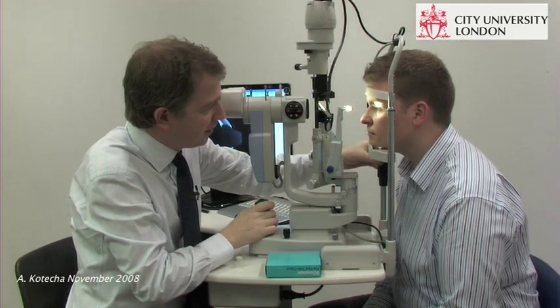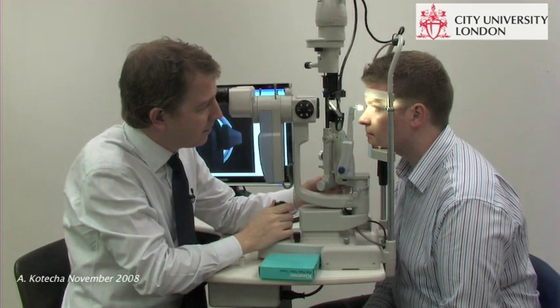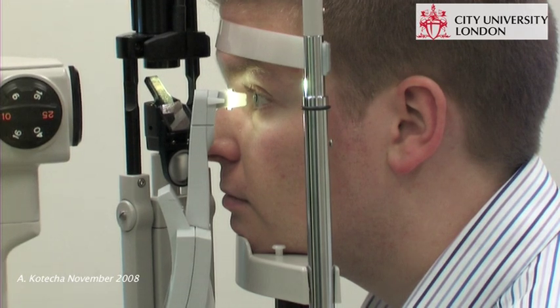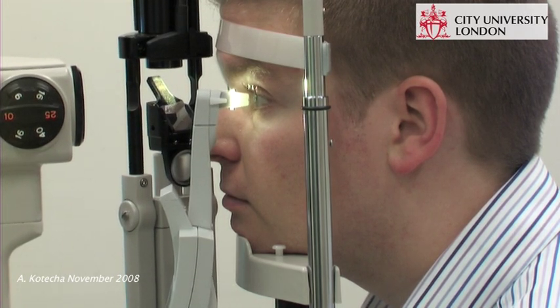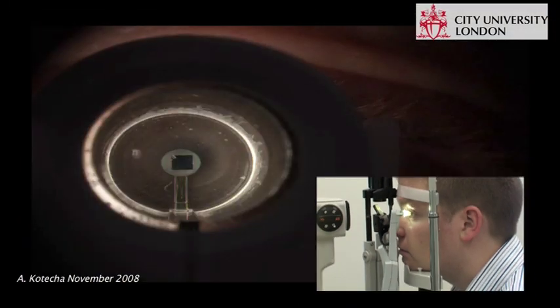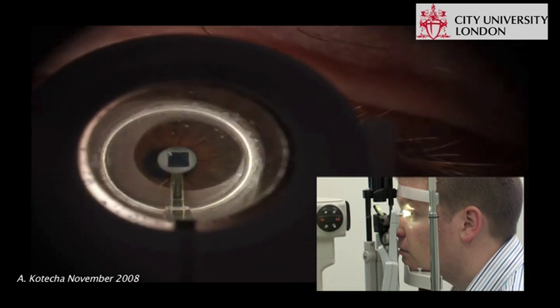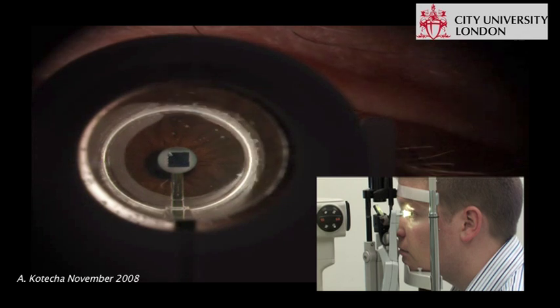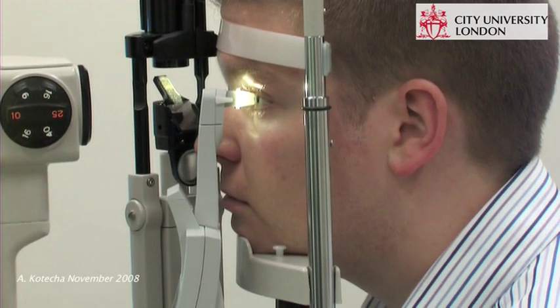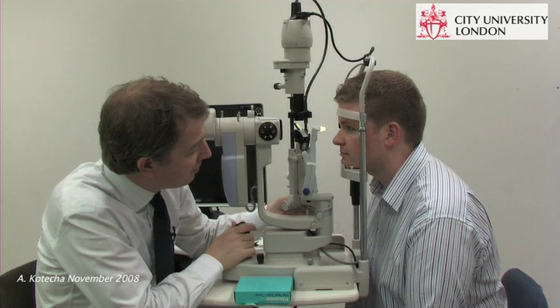Put your chin on there. Is that comfortable? Mm-hmm. Eyes wide open. That's great. Sit back, please.